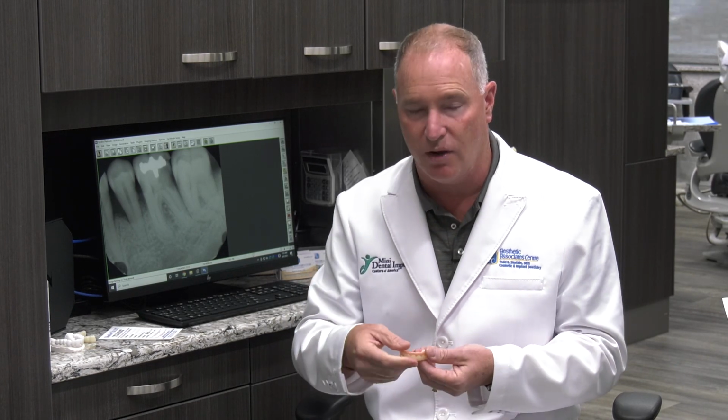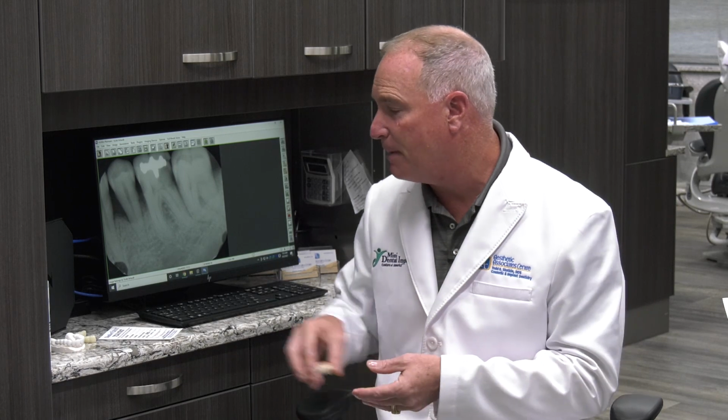I squirt it in the trough, pick up those housings at the time of implant placement, and the patient has a nice looking temporary to wear for the next several weeks while we're going through these steps to fabricate the final restoration. That's pretty much it. At that point, you should get back a permanent restoration that looks beautiful, fits beautifully, and is aesthetically pleasing to the patient.